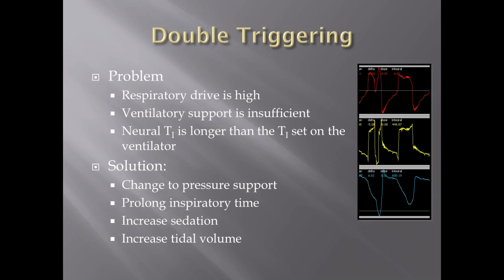Some patients I go down on the flow, some I go up, and often this helps. Increasing sedation, which we'll talk about in a minute. Increasing tidal volume is obviously not ideal either, but theoretically can decrease double triggering.